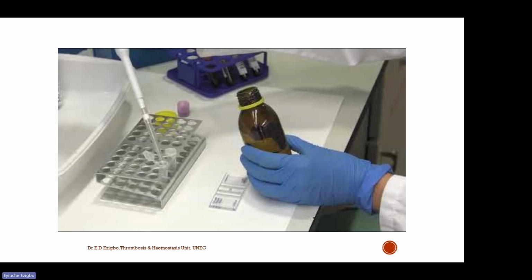When charging the chamber, as you're doing it, you also avoid forming bubbles. You can see the view under the microscope for counting red blood cells.